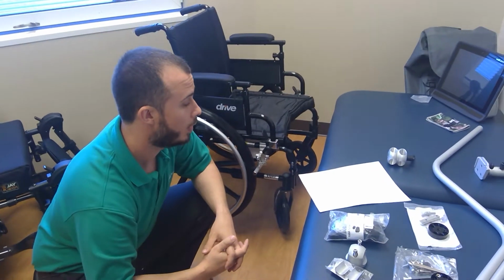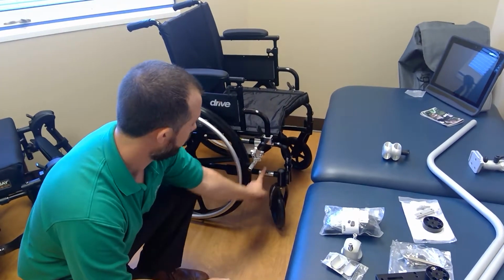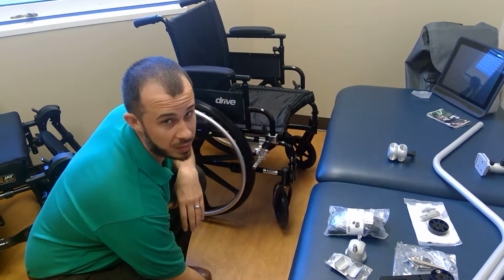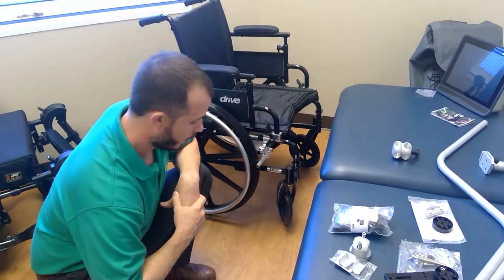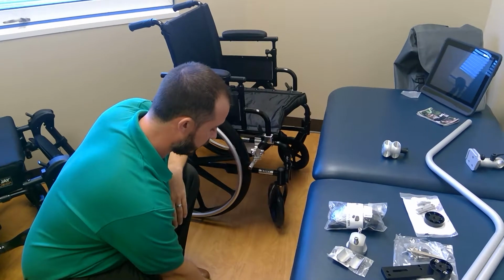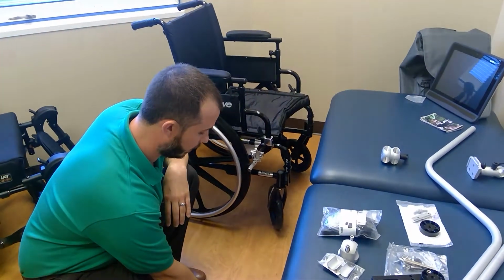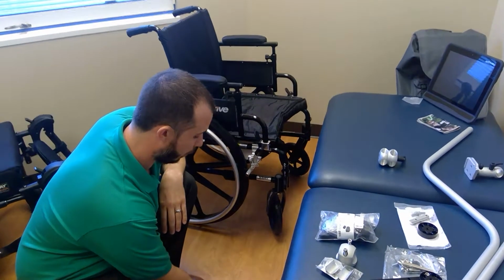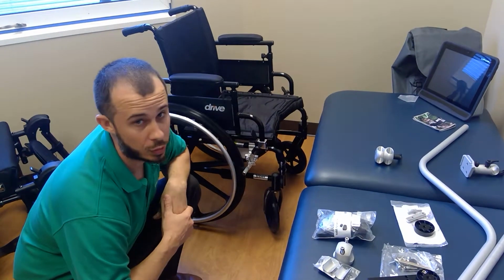So the most common tube measurements are going to be 2 3/4 inches around, which is 2.75 inches in decimal form, and then 3 3/16, which is going to equal 3.1875 in decimal form. So in order for us to figure out what size that tube is, we're going to take 2.75 divided by pi, or 3.14, and that's going to tell us that it's 0.875, which is a 7/8 inch tube. For 3.1875 divided by 3.14, that's going to tell us it's a 1-inch tube.